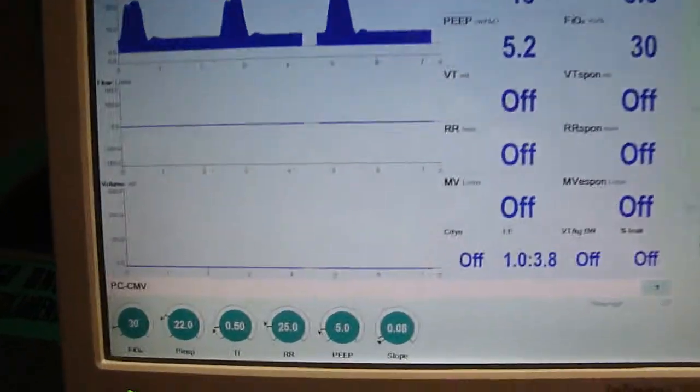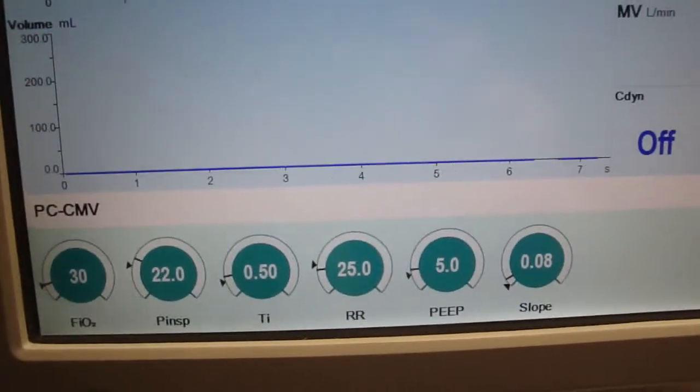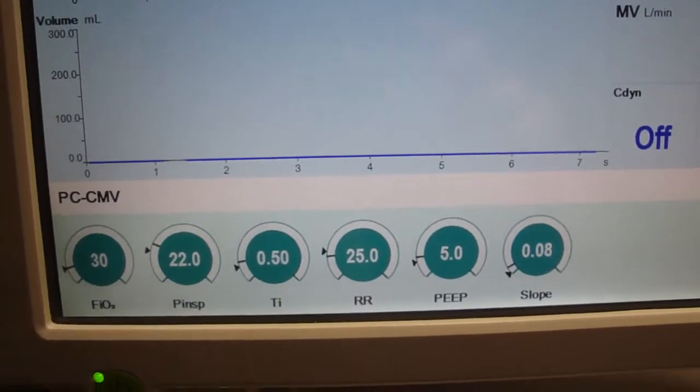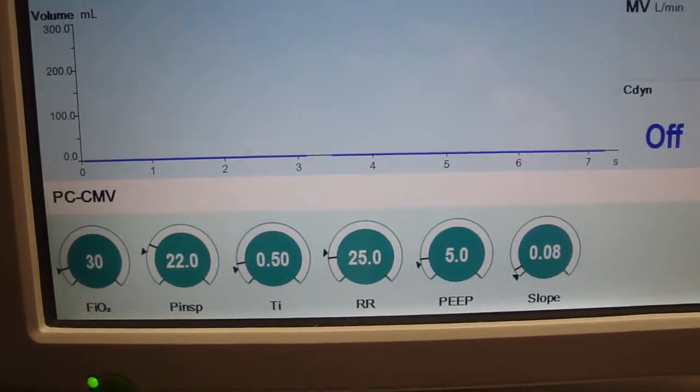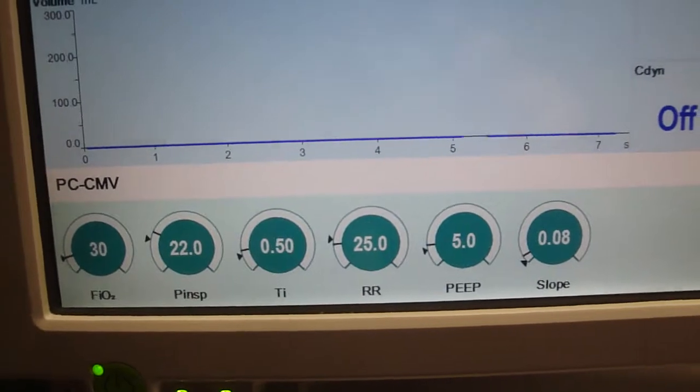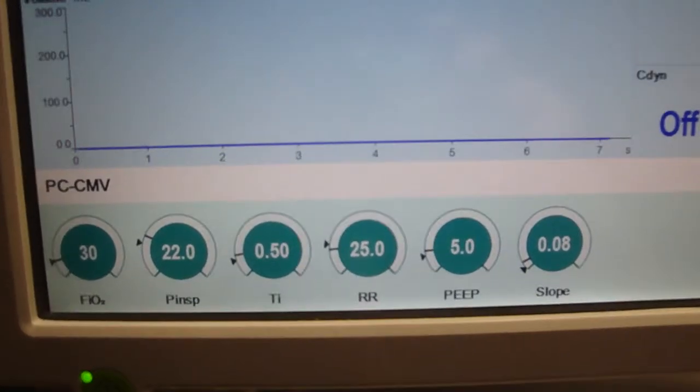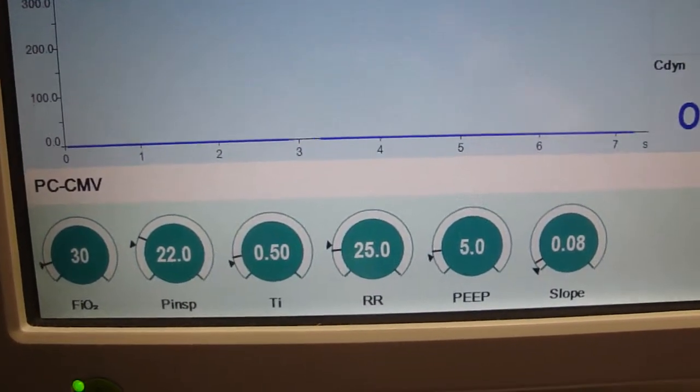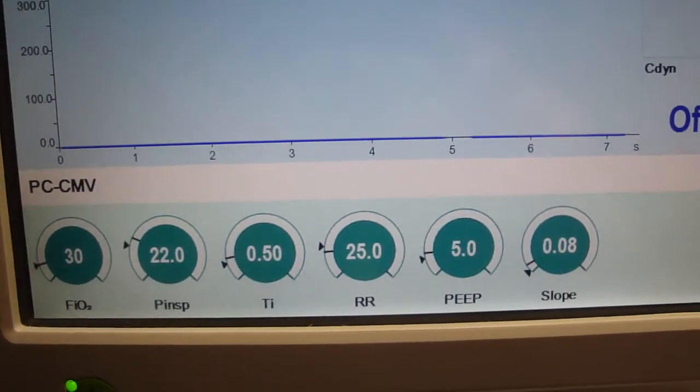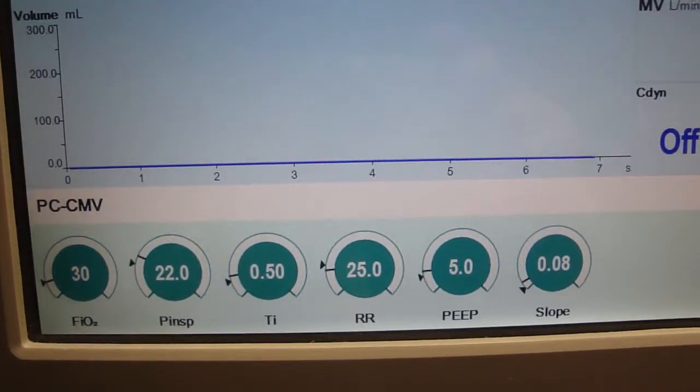As you can see down here in the left hand corner, these are the settings. FiO2, Peak Inspiratory Pressure, I-time, which typically in NIV is longer than in traditional ventilated invasive mode, respiratory rate, your PEEP, and then we have our slope.